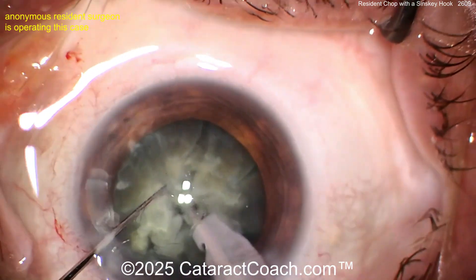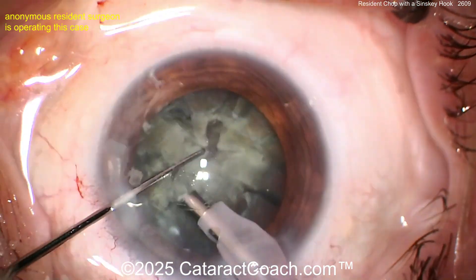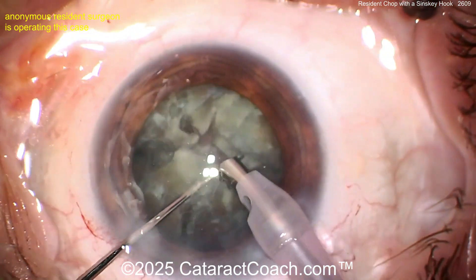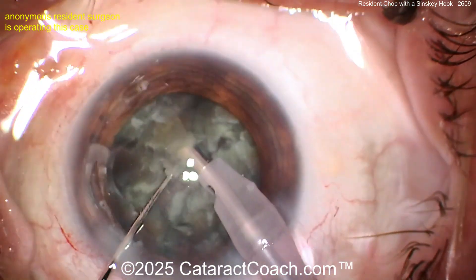Let's go back to this case. Doing a good job here with a lot of little chops on a reasonable cataract. Now let's start taking some pieces out of the eye — buzzing into them and getting them out. The Sinski hook is enough; you don't need fancy instruments, I promise you.